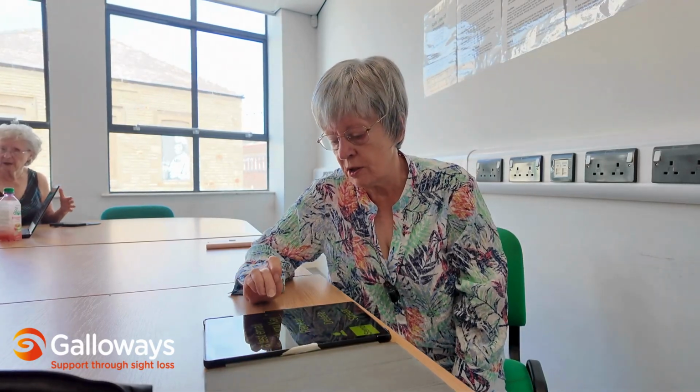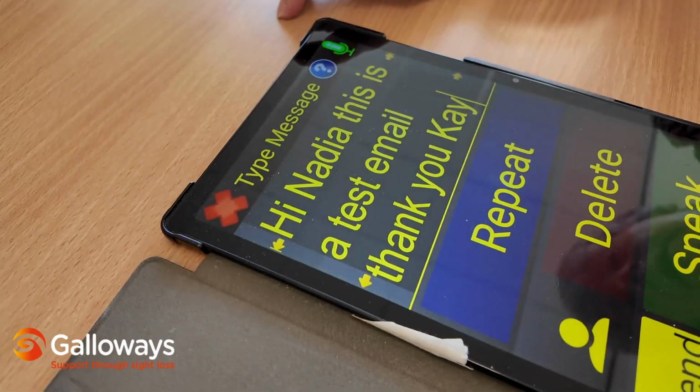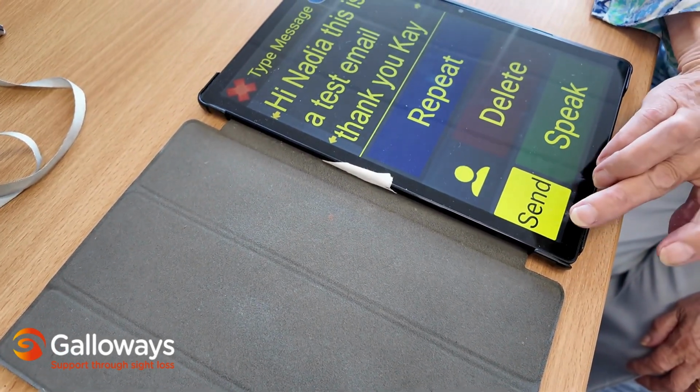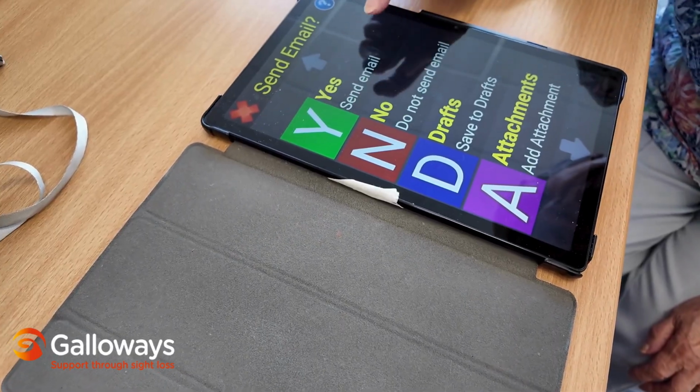Thank you, Kay. Now it's not 100% perfect because it has actually done K that time. Sometimes it will just come up with the letter K. It's a bit inconsistent, but it's been friendly to me today. So then all I've got to do, again, is that big Send one. Send email.